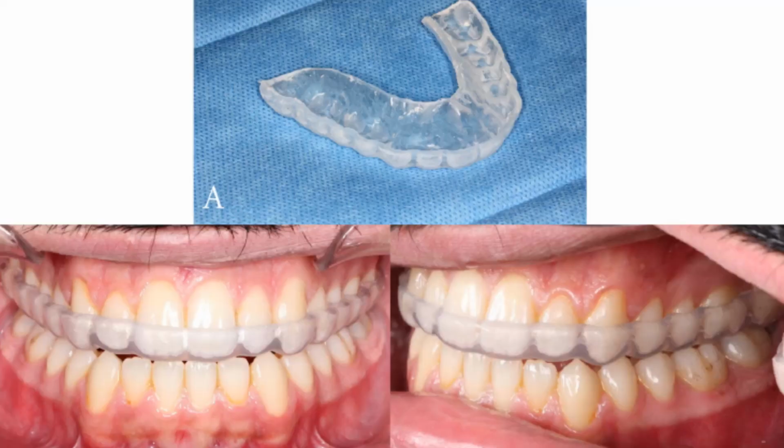So all in all, you have to understand that these are the kinds of splints. You have pseudo-permissive splints as well, that could include stuff like hydraulic splints that are known as aqualizers. Let's not get into detail. That is basically a water-filled appliance splint that you can wear, and that basically adjusts the jaw forces and all those things.